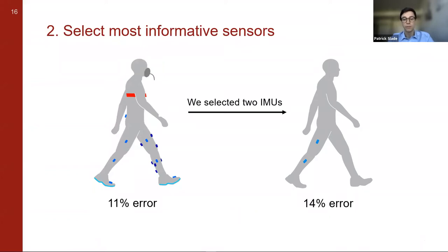And the system is very accessible. So these IMUs are low cost. They're about $10 to $20. They're low power and they're very common. And there are actually companies now developing pants or clothing with these already embedded in them. So you don't have to worry about trying to wrangle your own device. So you can imagine soon you might go outside to run in your Nike shorts or whatever, and they'd have these sensors already embedded in there, and they'd be able to talk to your phone and provide really accurate estimates of energy expenditure.